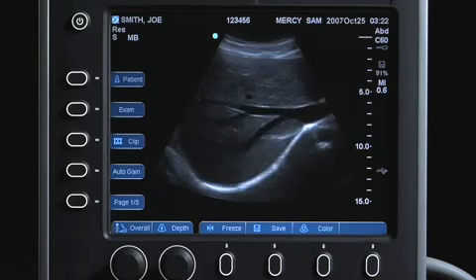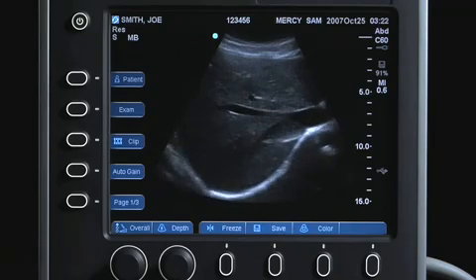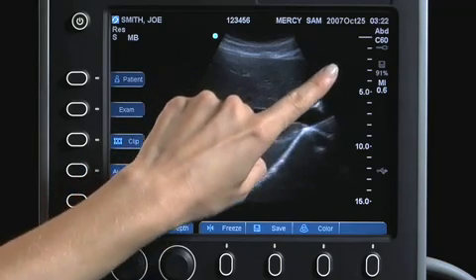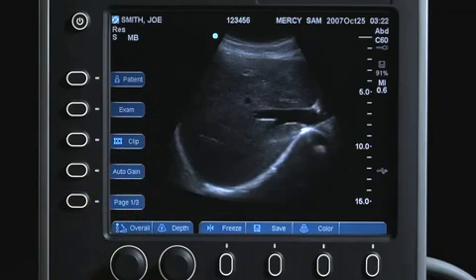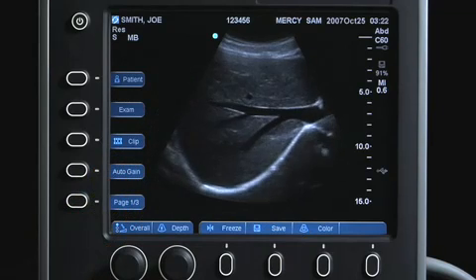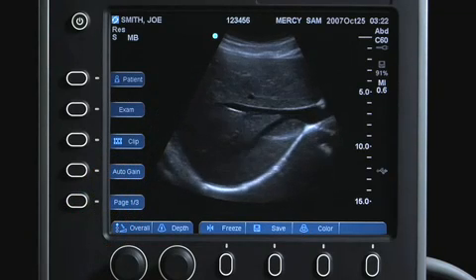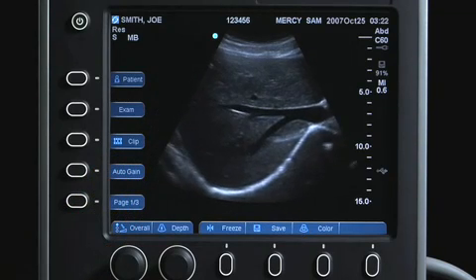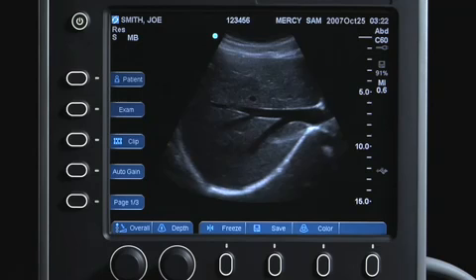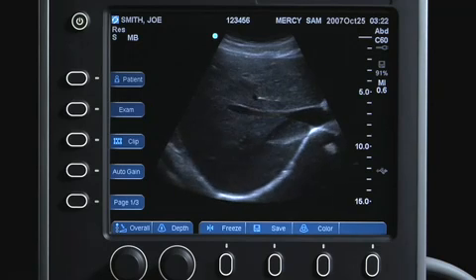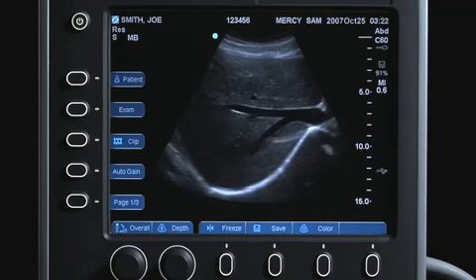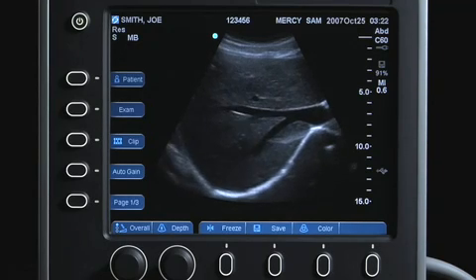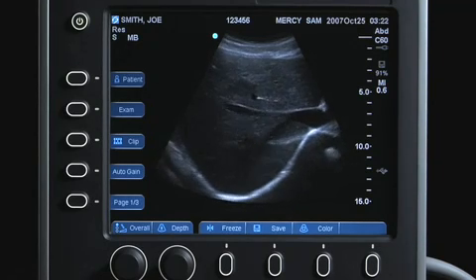Moving to the left, the depth marker displays marks in 0.5 cm, 1 cm, and 5 cm increments, depending on the depth. The size of the depth marker scale can be adjusted in the system presets.